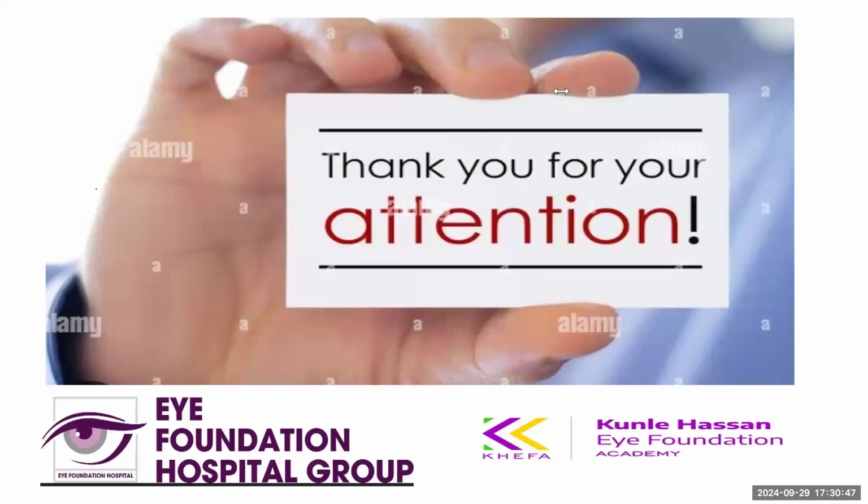But yes, that could happen. Also watch out for hyperlipidemia. If your patient has hyperlipidemia, you may want to scan, control, and check again, and then you'll be able to interpret your results accurately. So never say never. Any factor you see in the patient that could affect your result, please go ahead and take care of that too. All right.